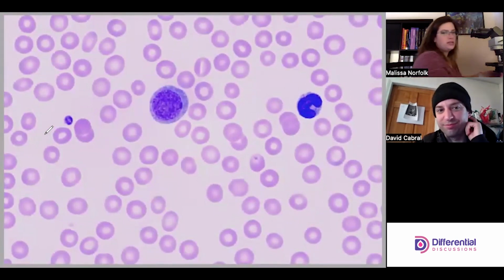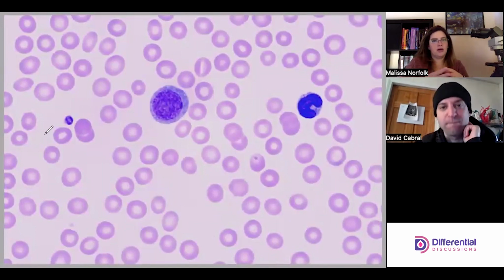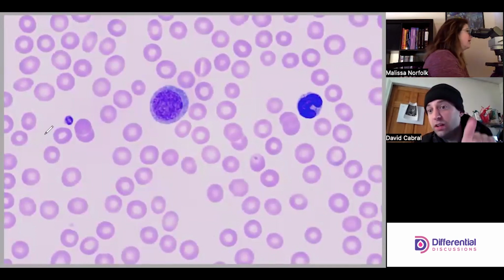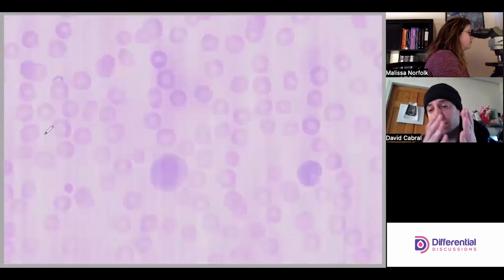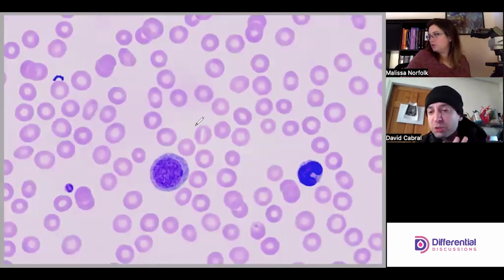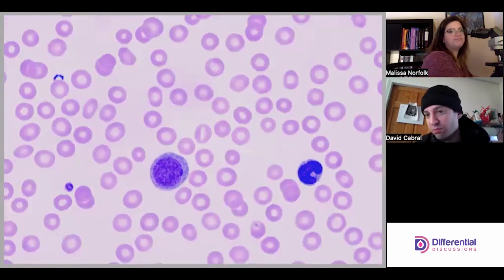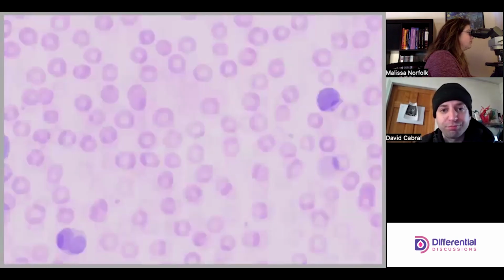I think the other thing, this one's not doing it as much, but a lot of times in red cell morphology, you see a lot of stomatocytes on an albumin prep. There's one at the top of the field above that pro lymph. So for the most part, the red cells are behaving, but because of that cell and others that could look like it, you don't want to be using this for red cell morph.